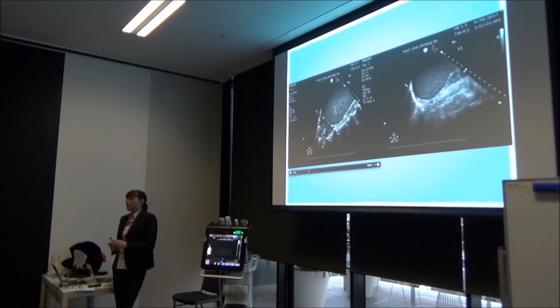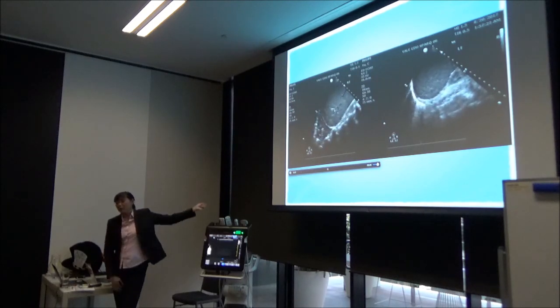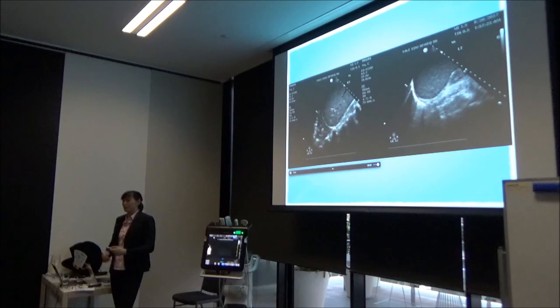So, doing a combined heart and lung exam, we were able to exclude CHF, no B lines, exclude CHF or ARDS or anything like that. We have unilateral B lines, which supports a more focal process, and then we isolated the focal process that's a consolidation and pneumonia that's causing her sepsis.